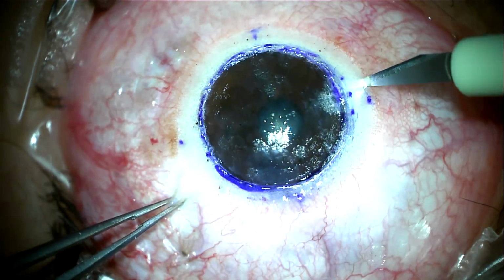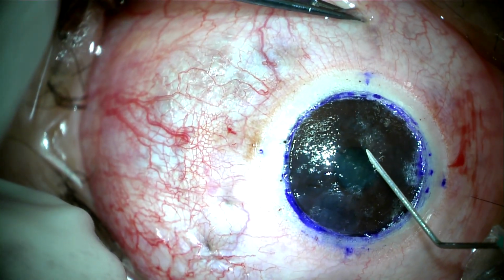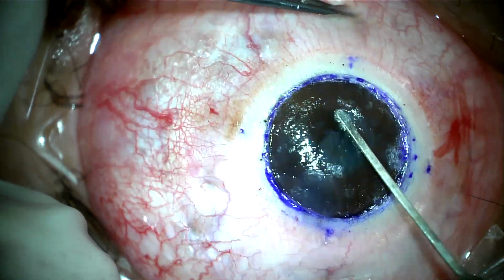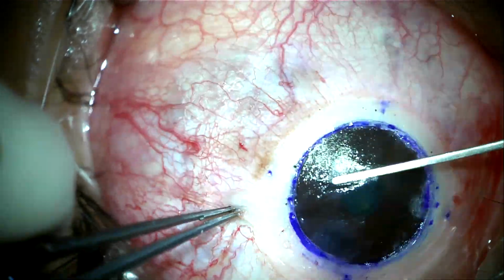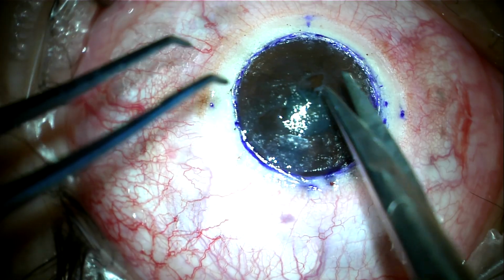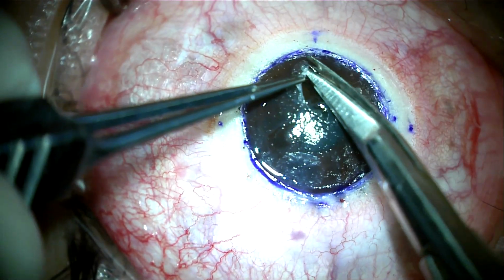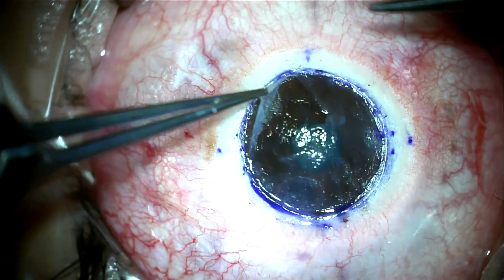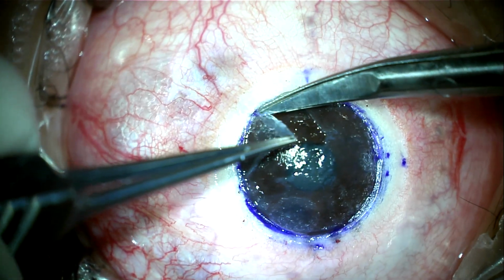A paracentesis is then done, followed by opening one of the small microbubbles and introducing a spatula to dissect more stroma. Dissection in the area of the type 2 bubble should be the last part to avoid access to bare Descemet membrane. Cutting the dissected stroma is then done after dividing it into 4 or 5 quadrants. Now the bed consists of a very thin layer of stroma, a small peripheral type 2 bubble and Descemet membrane.